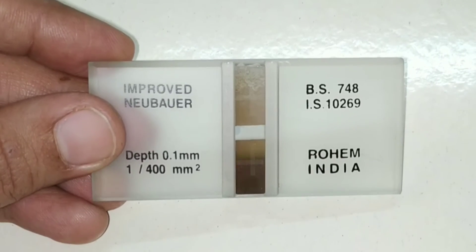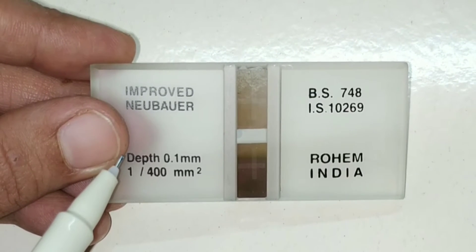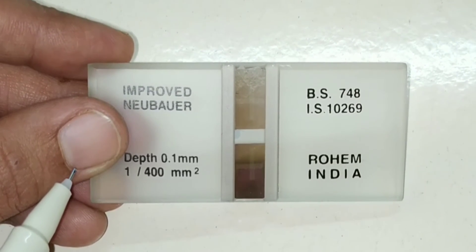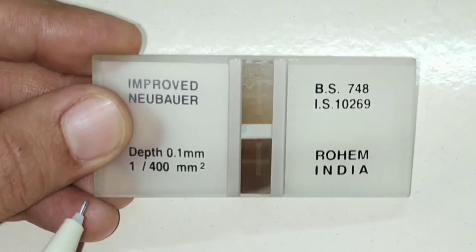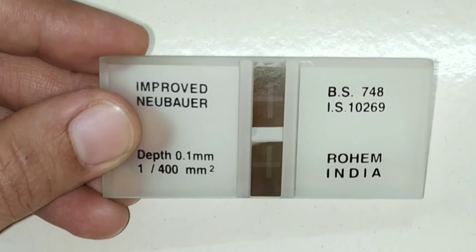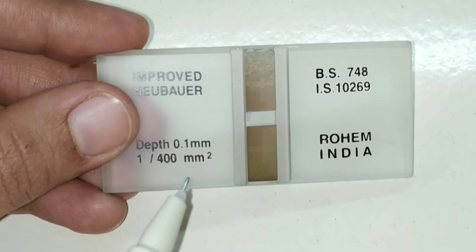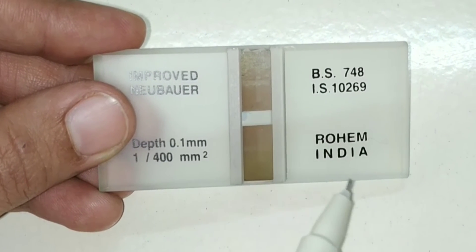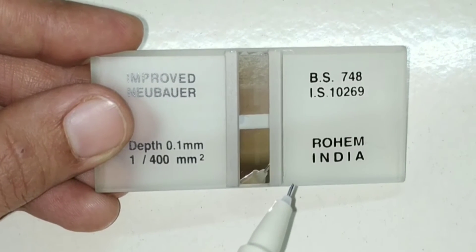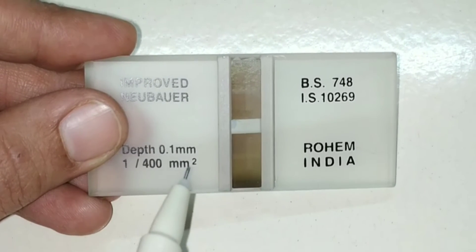Today we will discuss about the improved Neubauer chamber. It was invented by Kramer and modified by Neubauer. It is a single solid heavy glass slide and it has three parallel platforms. You can see here: one, two, and three. These three platforms are separated from each other by shallow gutters or grooves.